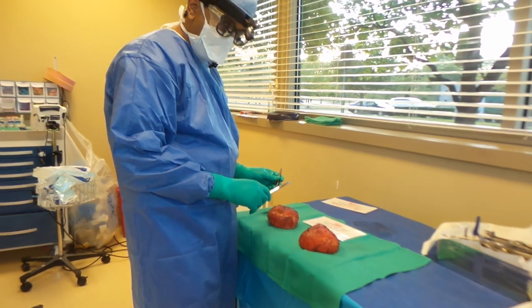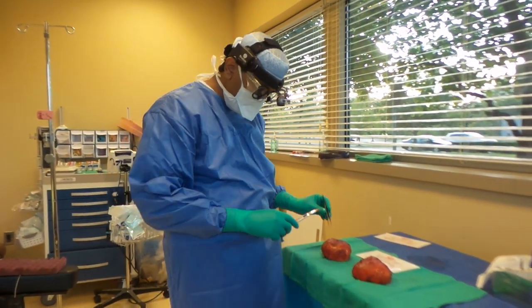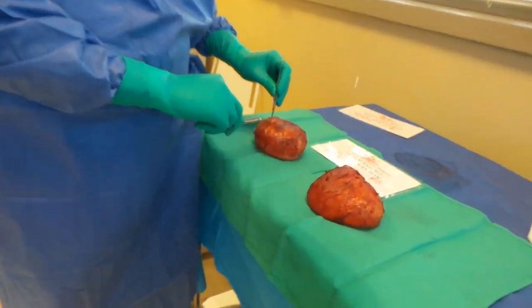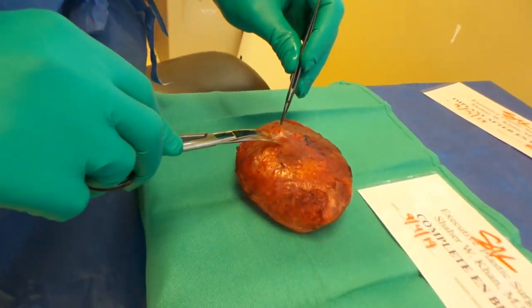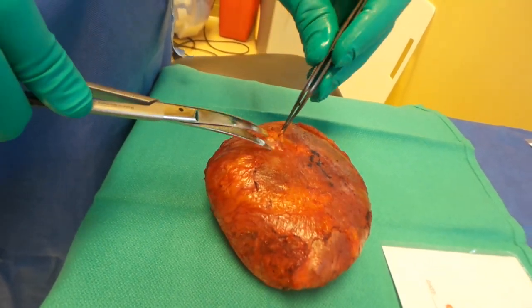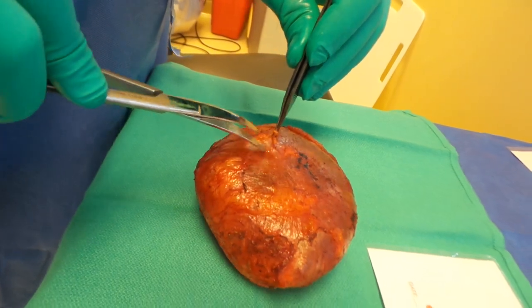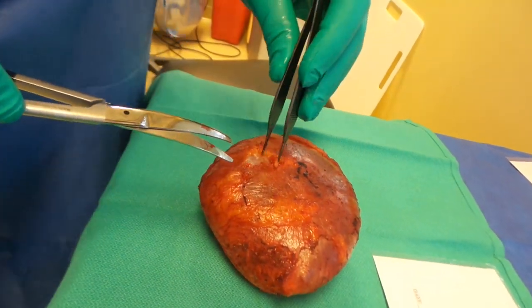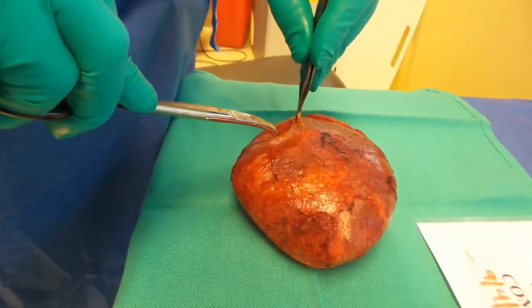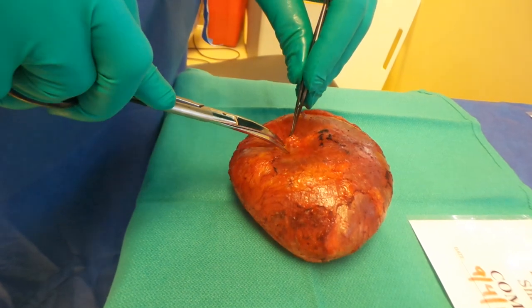For the first time, the implant is going to be exposed to the outside. We'll see what the consistency of the capsule is. As you can see, I am cutting this abnormal tissue that's encased around, trying to find an area where I can easily penetrate this very thick capsule, which I will call a grade 2 capsule or contracture — relatively very thick abnormal fluid.